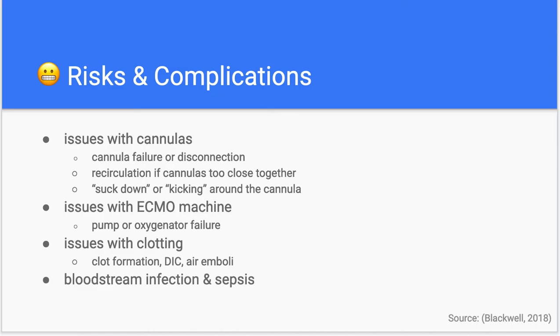And again, with any machine that takes blood out of the body and puts it back in, you're thinking about clotting, potential DIC, different kinds of embolisms, like air embolisms. That's similar to what you'd expect with a dialysis machine as well.